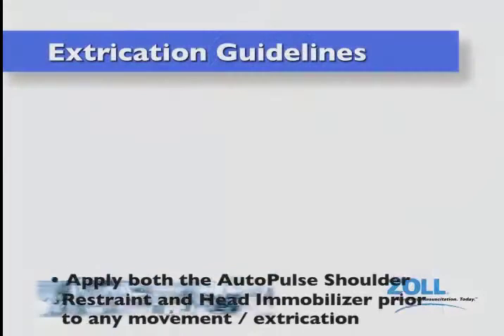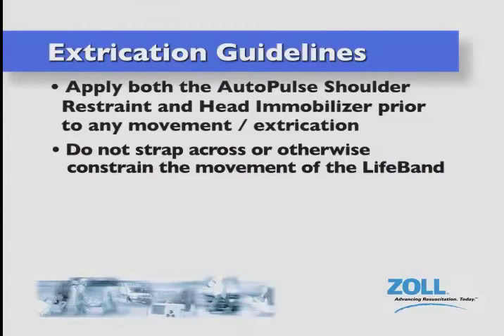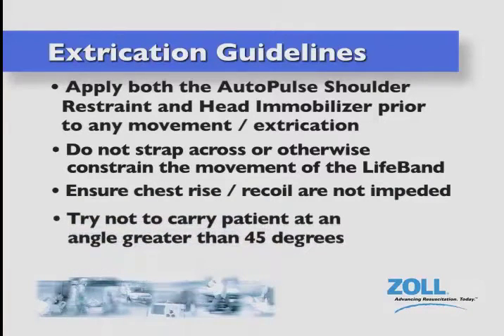When you need to move or extricate a patient on the autopulse, do so according to the following guidelines. Apply both the autopulse shoulder restraint and head immobilizer prior to any movement and or extrication. Do not strap across or otherwise constrain movement of the life band. Ensure that chest rise and recoil are not impeded. Try not to carry the patient at an angle greater than 45 degrees.